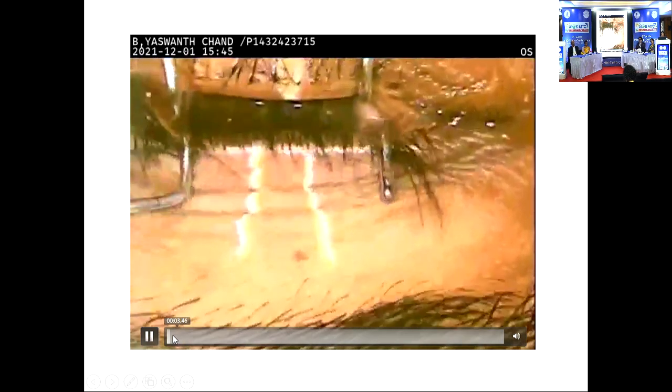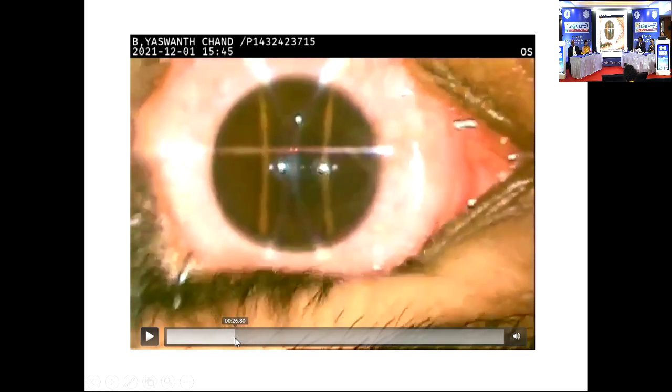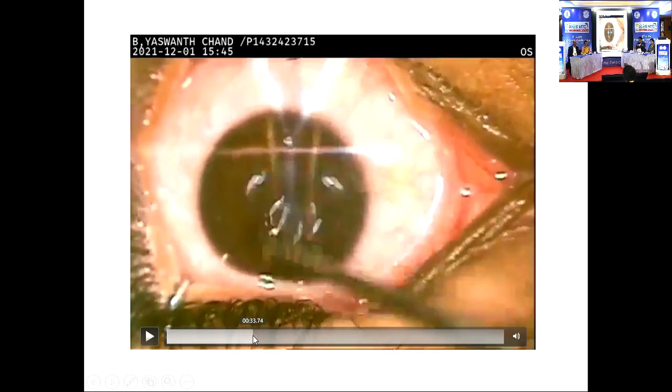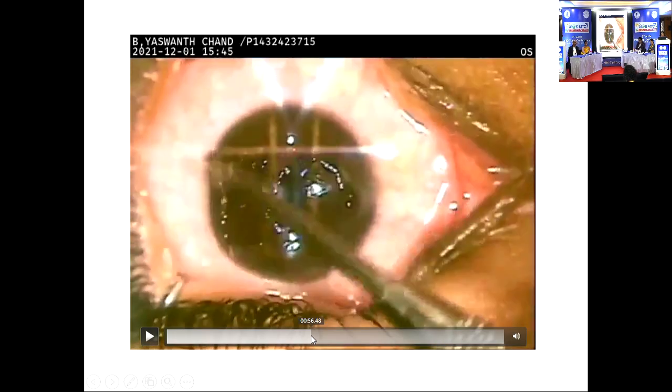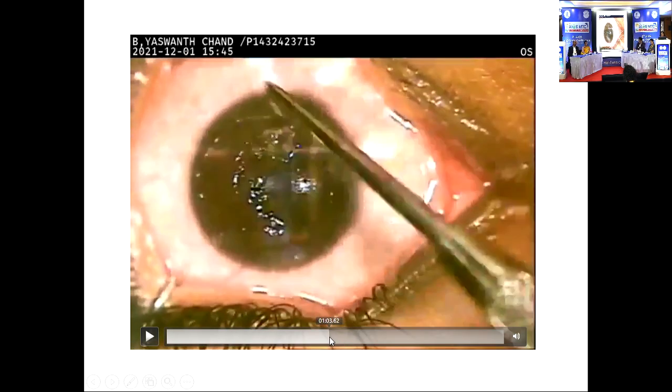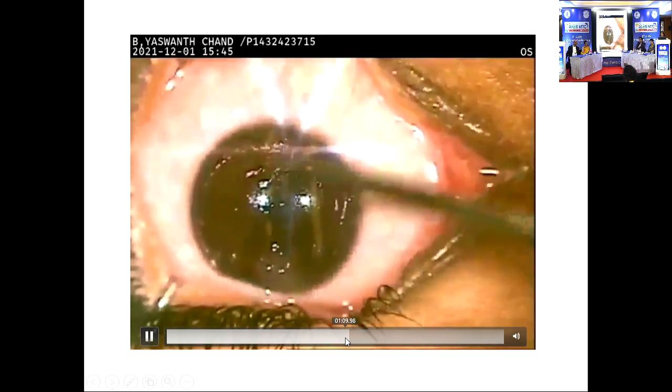And going back to the previous one, what you will be doing is you have to mechanically remove it. It's not very difficult, but patients sometimes are not very cooperative. So you are going to make an epithelial marking as to how big your circle should be. You can do it by yourself. It's a circular marking that you want. You'll slowly debride and make it smooth. Take care that there's no island. There should be no epithelial island remaining, because that area would not be ablated otherwise.